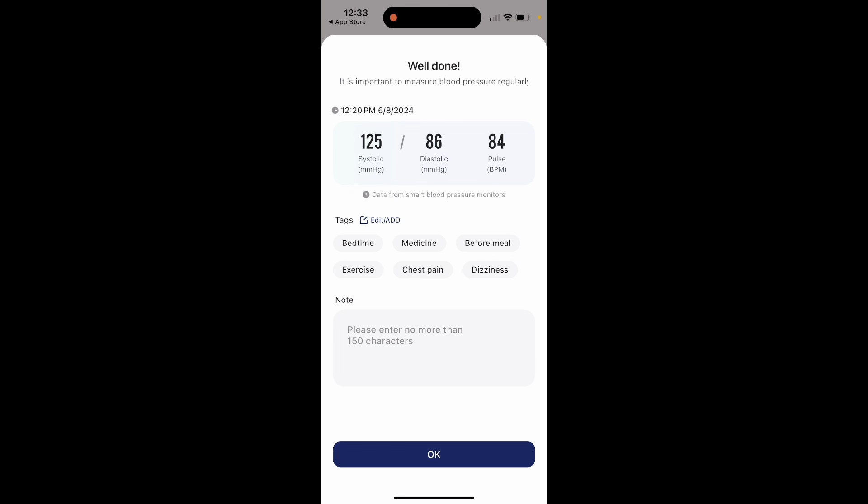Maybe it was before a meal, and then I can go ahead and put a note in here as well. It looks really good. I really like the app — very easy to use.